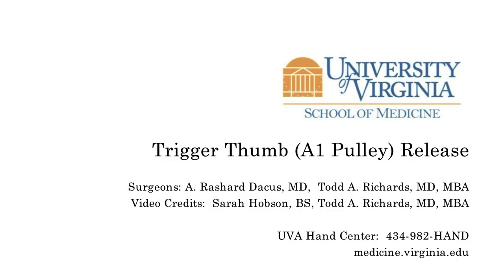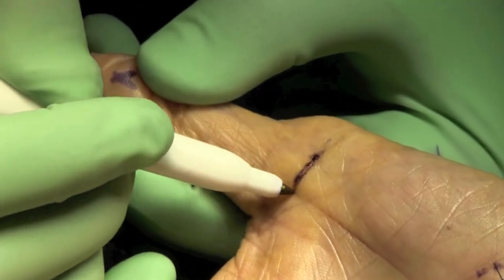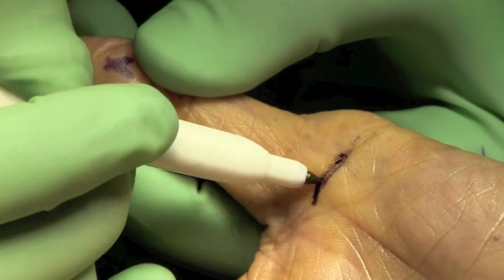This is Rashard Dacus discussing today a trigger thumb or A1 pulley release. Here we're making our transverse incision in the flexor crease along the area of the A1 pulley.